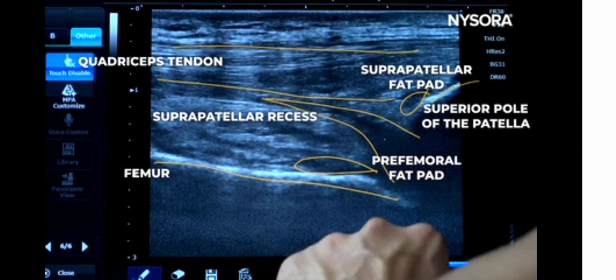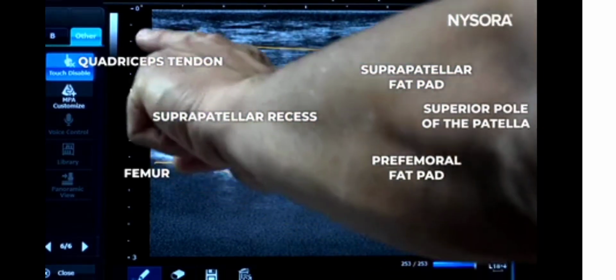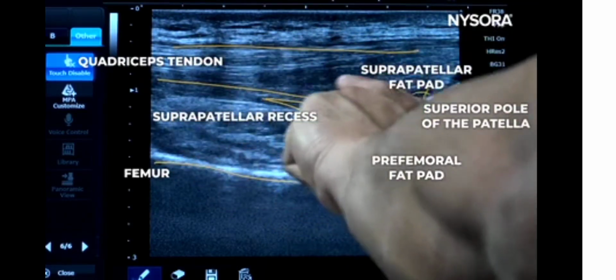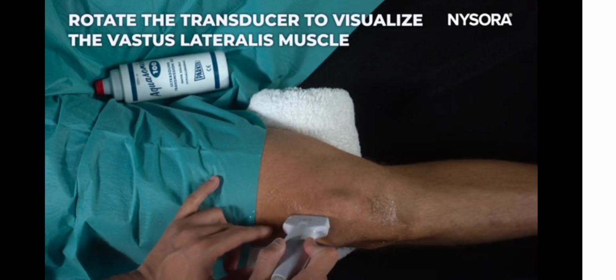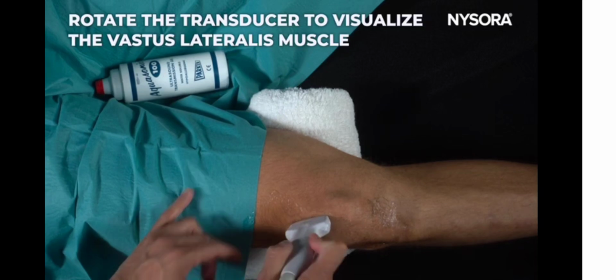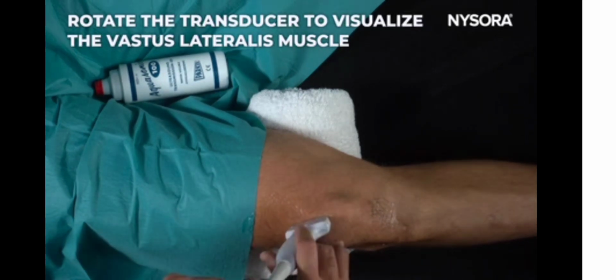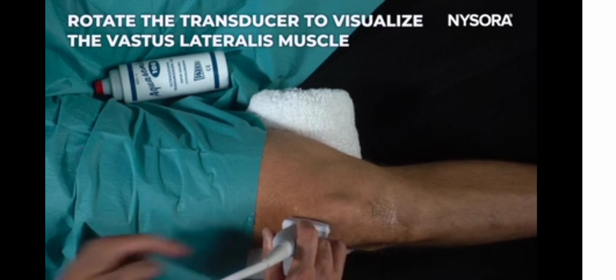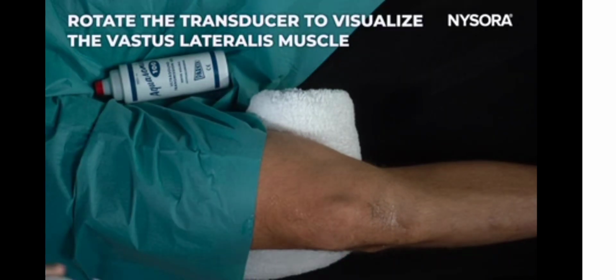This recess can be targeted with an in-plane technique, but unfortunately you will have your quadriceps tendon in your view. So the tip here is you will move the proximal end of your probe slightly lateral, allowing you to look at the vastus lateralis muscle instead of looking at the quadriceps tendon, and the needle you will bring in is in-plane technique.